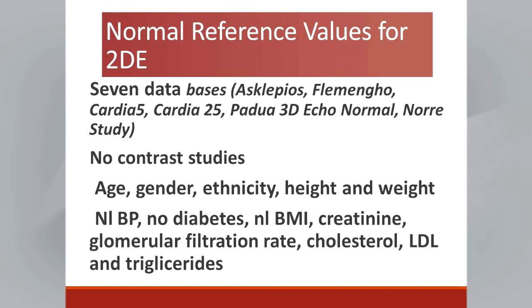The data that we will be presenting comes from 7 databases. Some of them come from Europe, some of them come from the United States, and they have been averaged, and I think this constitutes really a very sound database. None of these studies use contrast, so all of the data come from non-contrast studies.